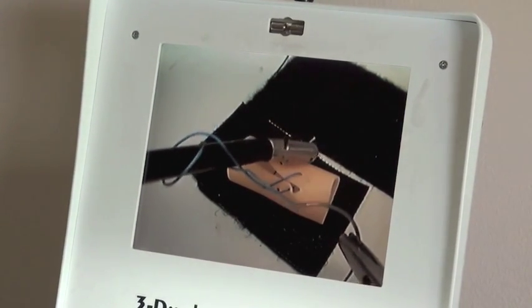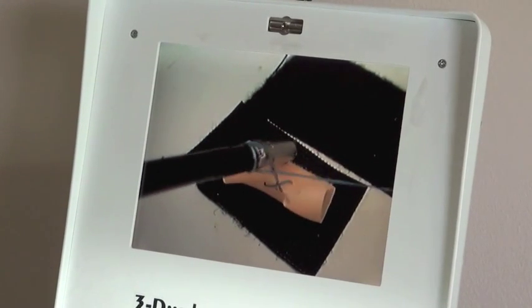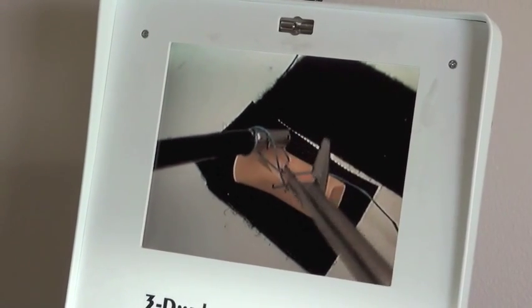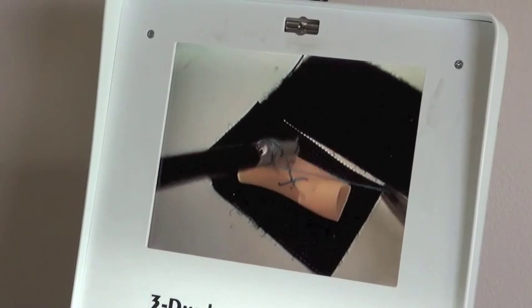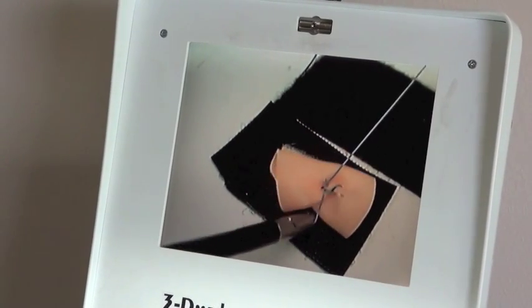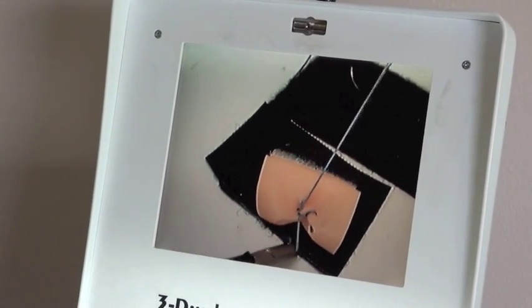I'm going to grab my tail with my left hand. Don't ever let go of that tail. And push this down. The flat knot. There we go.